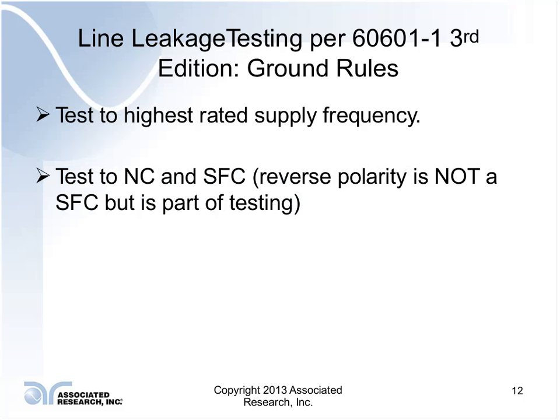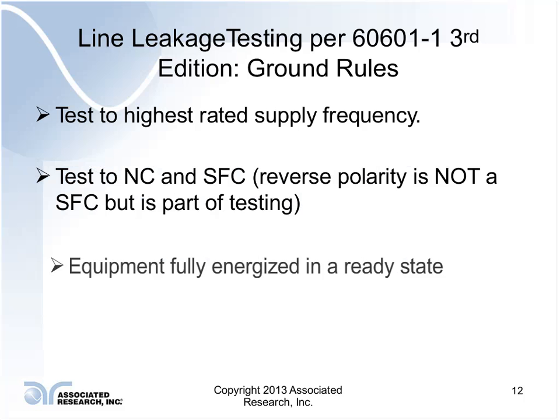You're going to test normal conditions and single fault conditions. And again, keep in mind reverse polarity is not a single fault condition, but it is part of the testing, so you have to account for it. I believe in the diagrams for the standard, they call it switch S5, and it's going to tell you to do it in all combinations of S5.